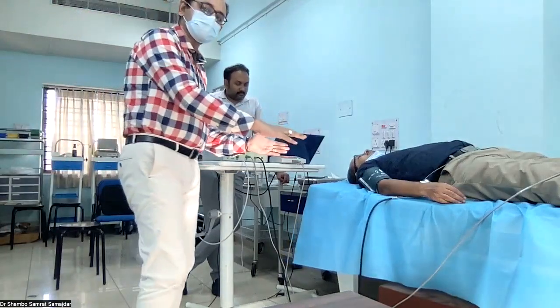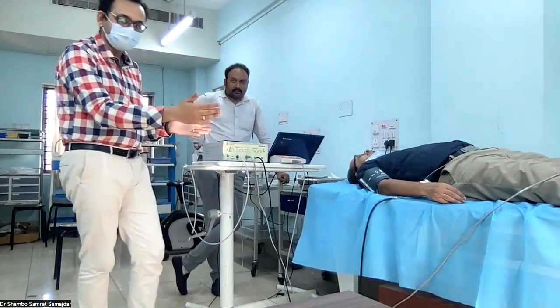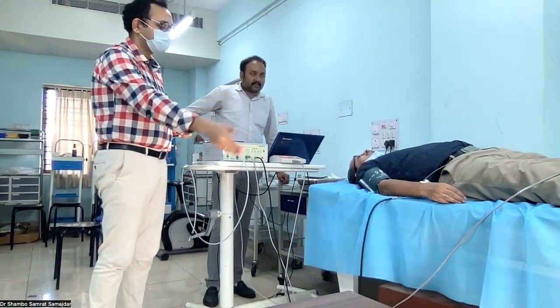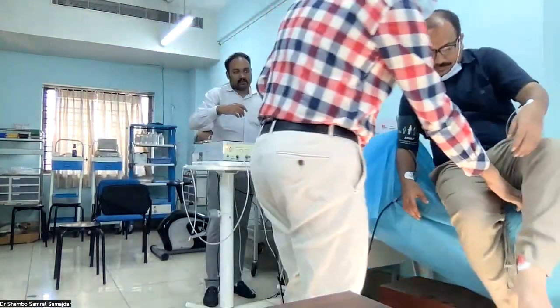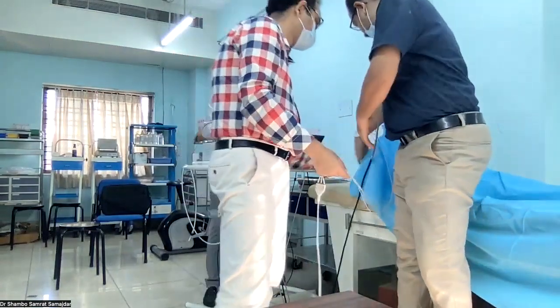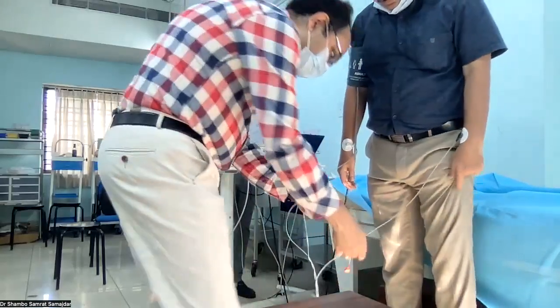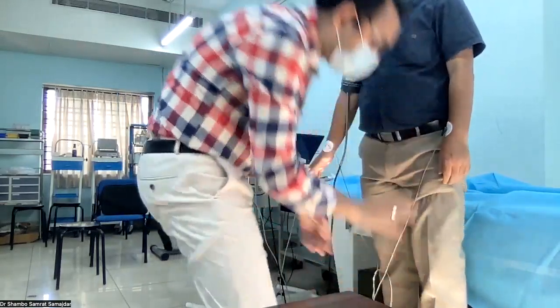There are some machines with head-up tilt tables available which can move automatically. And now we should ask the subject to stand, and after standing immediately we start recording the blood pressure. Please help him with this. Please stand. Ask him to be relaxed. Relax. Okay. We are recording. Just wait. No issue.